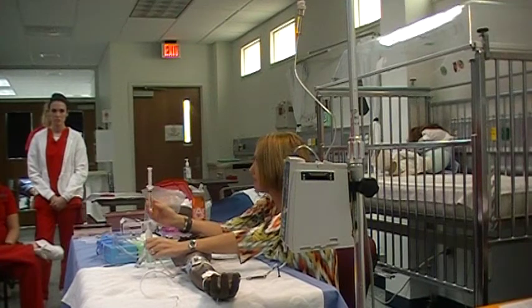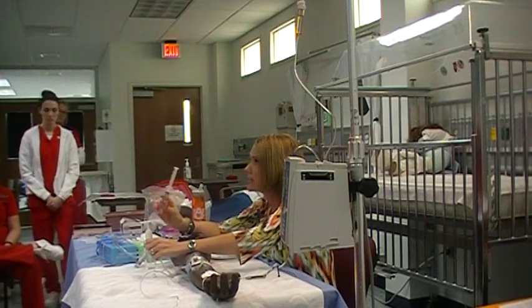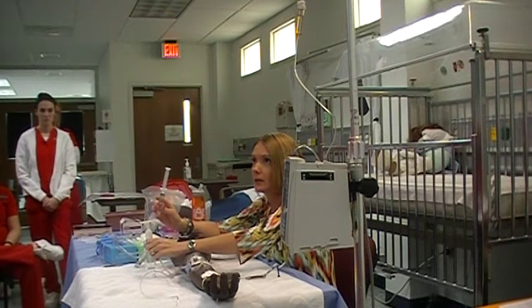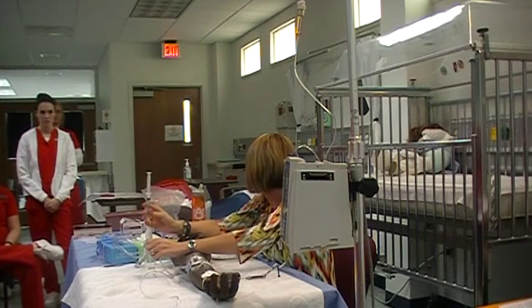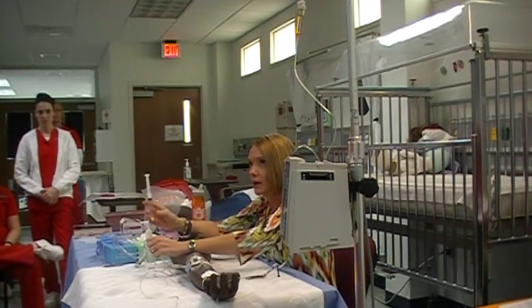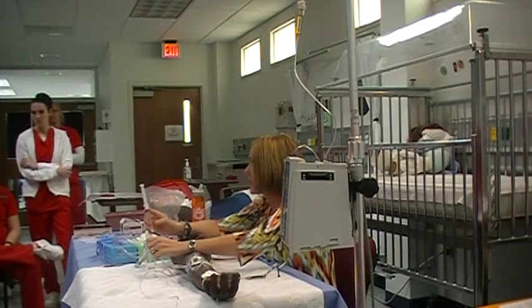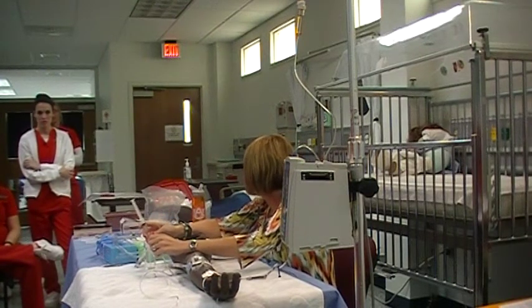Exactly. So you can give that fairly fast, right? In fact, I can check to see if my IV is patent with the first 10 mLs, right? Can't I do that and kind of save that step? So I'm going to make sure my IV is good at the same time I'm giving my 10 mLs, and I can give that at any speed. So that's what I do to save a step.